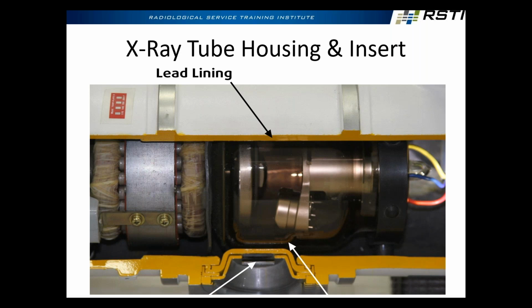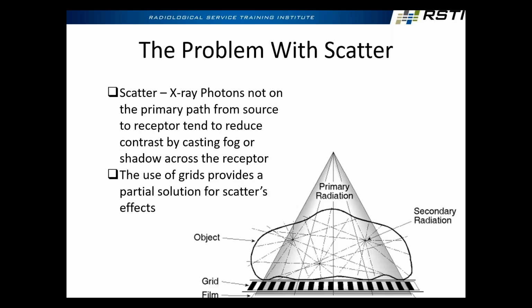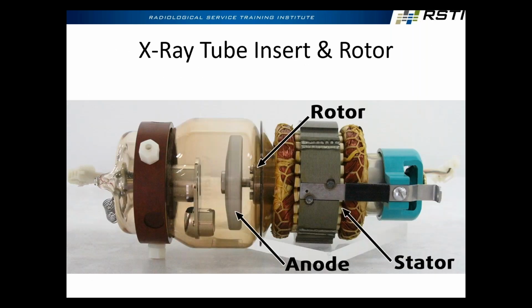Even though we are producing a heterogeneous, unmodulated beam of X-rays with many, many different wavelengths and frequencies, the intensity of that beam is not the same across the entire beam, right? Let's go back. Yeah, this will be better. So if we think of the beam that we're letting out as coming off of here, the intensity of the beam will actually drop as we get closer to the anode. In fact, in the area of the anode is where it is the least intense, but also the hardest, all right? Something they call heel effect.